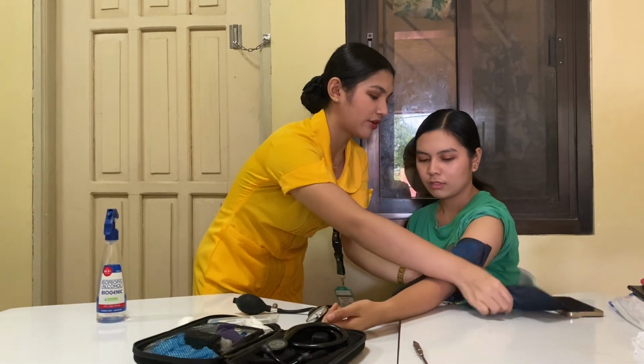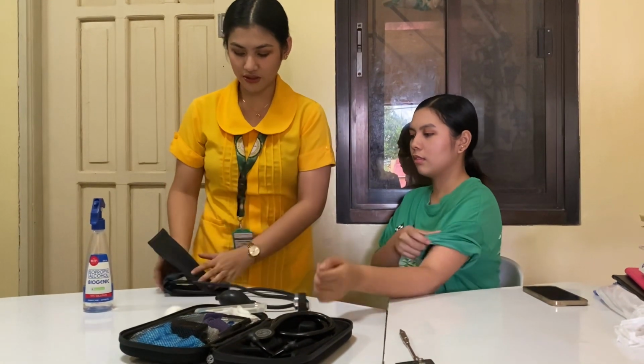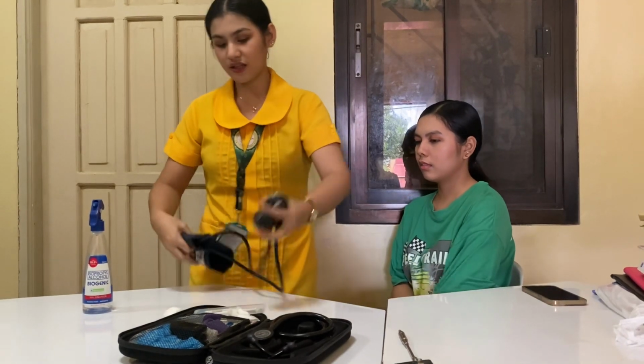So we're going to remove the cuff and then clean it with an approved disinfectant. And if this is your client's initial assessment, you have to perform it on the client's other arm. And if you don't have a stethoscope with you at the moment, you have to perform the palpatory method for assessing the client's blood pressure. So after that, we're going to document the client's blood pressure in the client's record and report pertinent data to the client's chart. So after that, that concludes the assessment of the vital signs. Thank you.